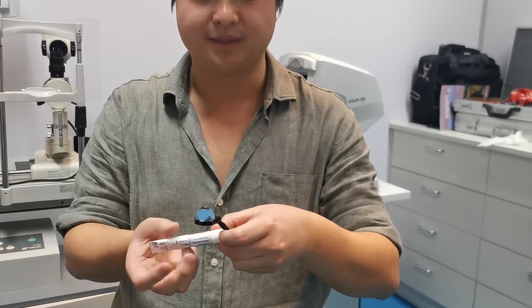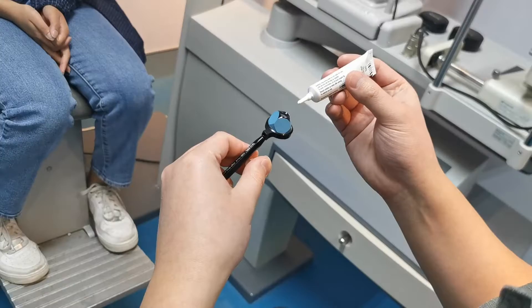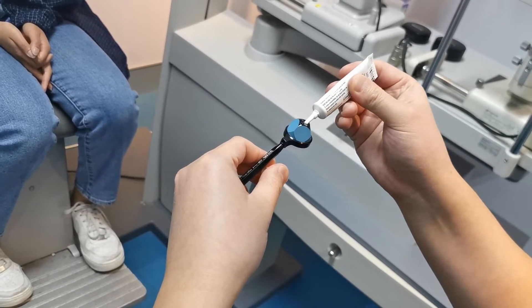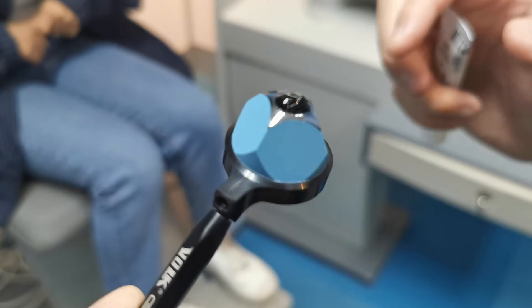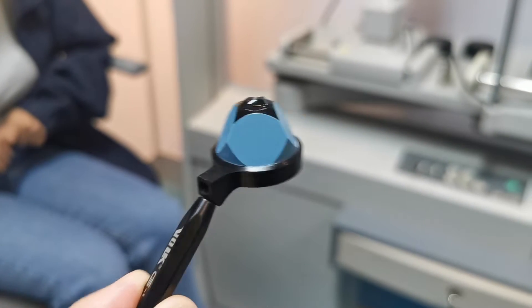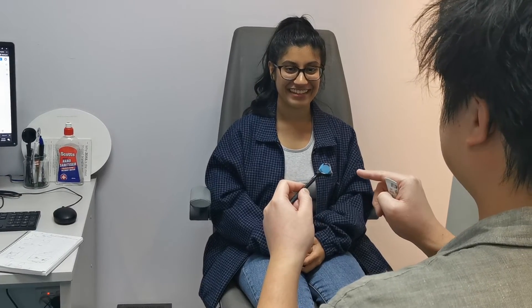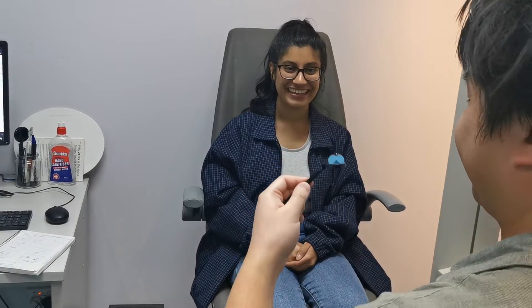Viscotears are important when using a flange gonioscopy lens, as it acts as a buffer between the patient's eye and the lens. Four-mirror gonioscopy doesn't require this, but I'll just show you here out of interest for correct application. You want a small blob of the viscotears in the concavity of the gondio lens. It's important to make sure there are no large bubbles in this blob, as this will obscure your view of the anterior angle. You may also consider using viscotears if it will help reassure the patient that the gel is touching the eye rather than the lens.